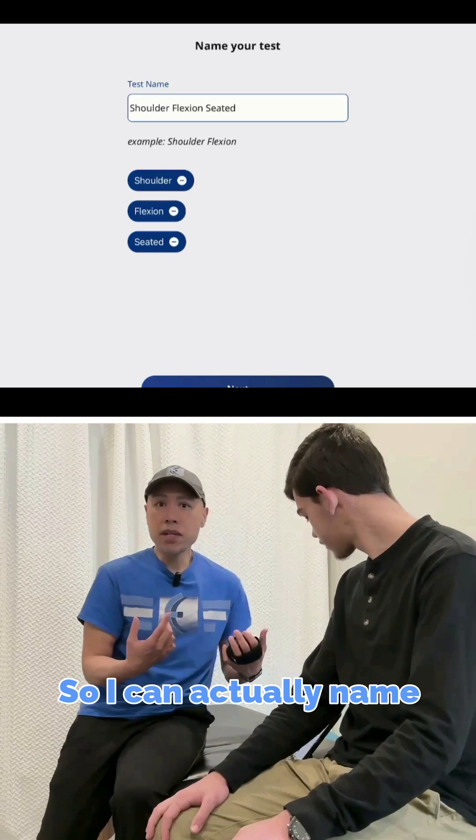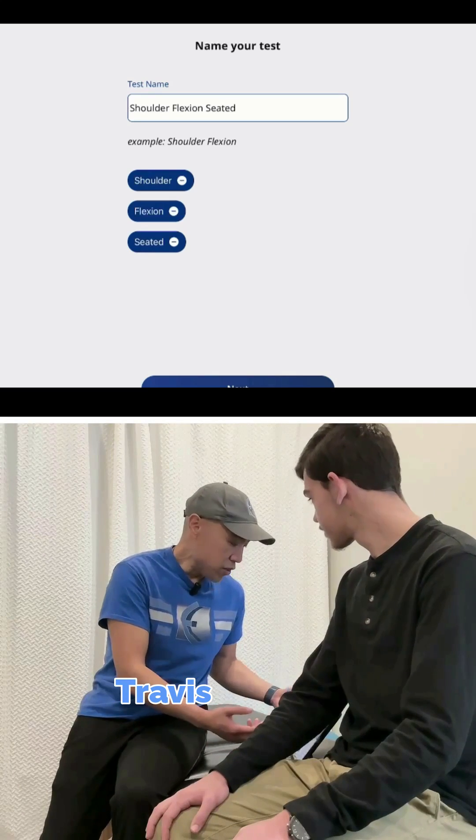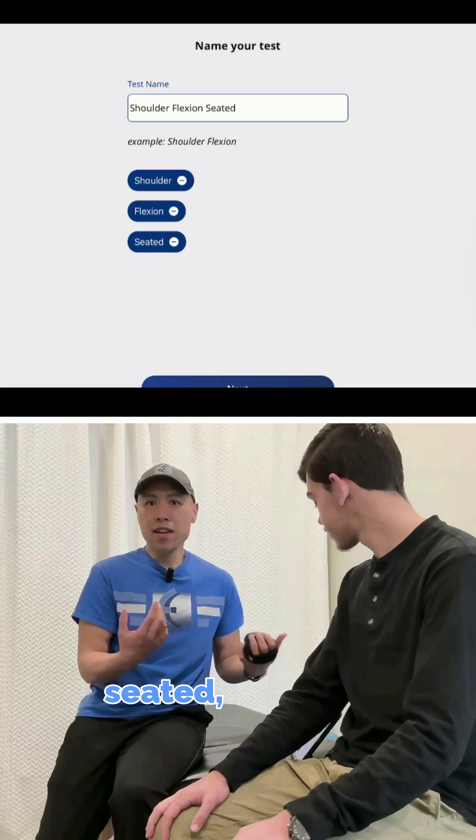So I can actually name it too, real quick — if I wanted to say Travis Shoulder Flexion Seated, and then Today's Date.